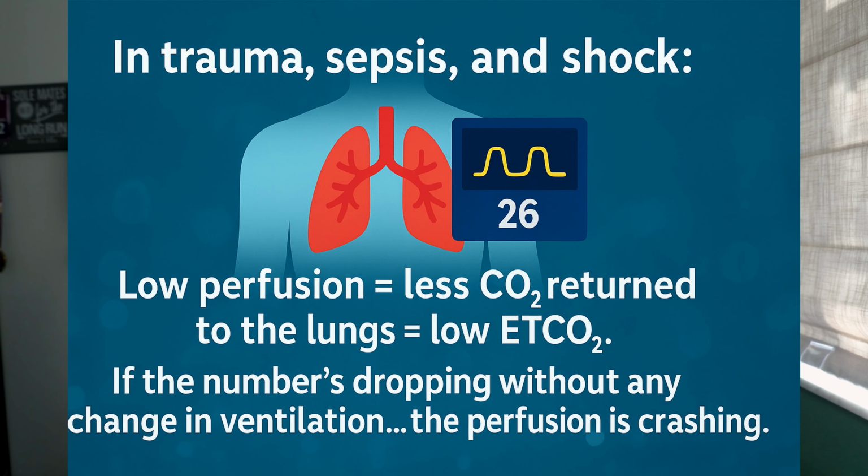So how would we use it during trauma, sepsis, or even shock? Low perfusion means that less CO2 is returning to the lungs. That means there's low end-tidal CO2. If the number is dropping without any change in ventilation, that means your perfusion is crashing. So you need to watch that patient.